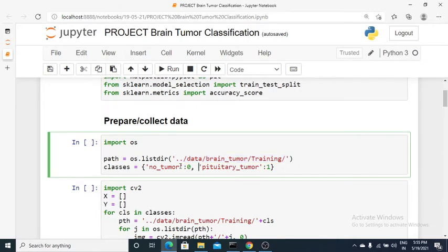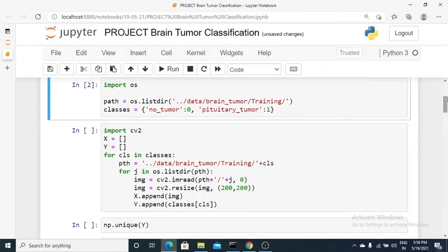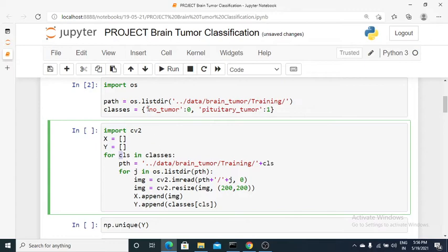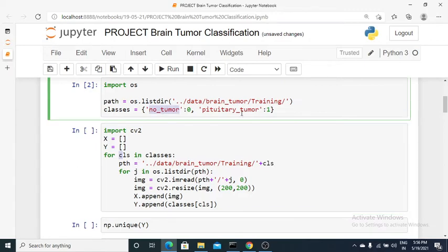Since machine learning works on numeric data only, I've labeled no tumor as class 0 and pituitary tumor as class 1. I've created two Python lists, X and Y. X will hold all the images and Y will hold the targets. In the loop, for each class — first no tumor, then pituitary tumor — we go into that class path.